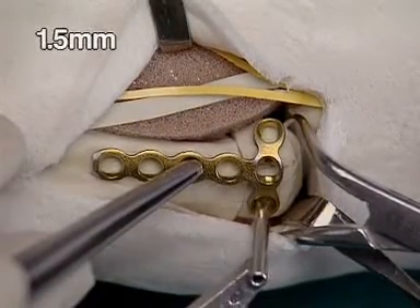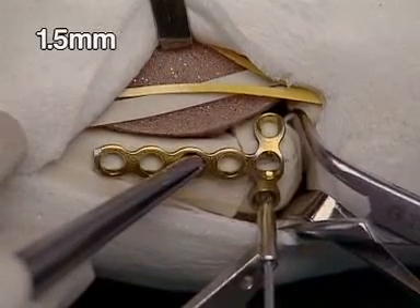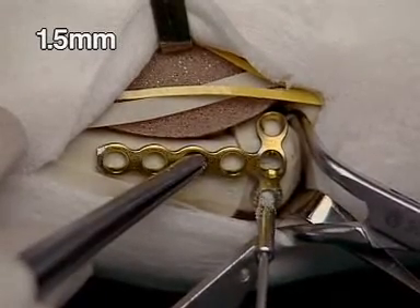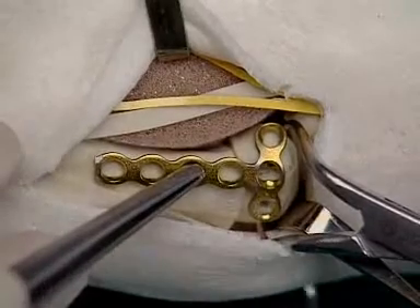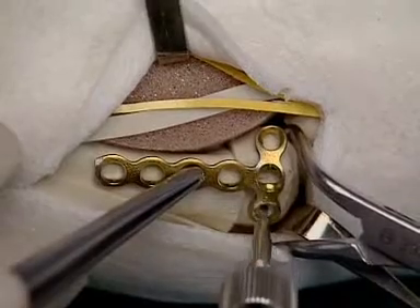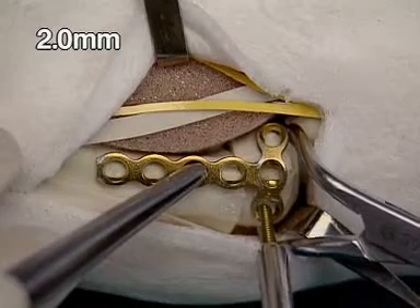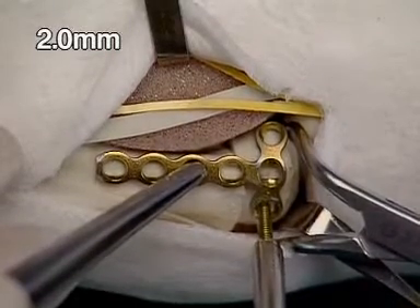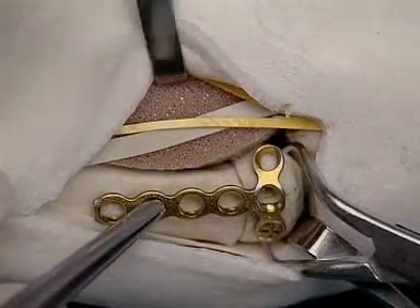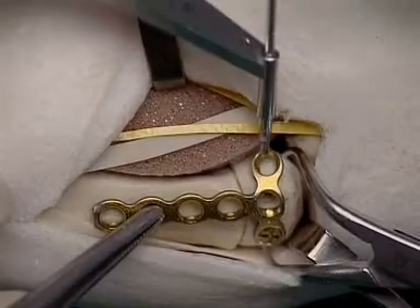Using the 2.0/1.5 double drill sleeve, the first screw hole is drilled through the radial hole of the plate with the 1.5 millimeter drill bit. The screw length is determined with the depth gauge. The appropriate 2 millimeter self-tapping screw is inserted. In the ulnar hole of the plate, the hole is drilled eccentrically with the 1.5 millimeter drill bit.